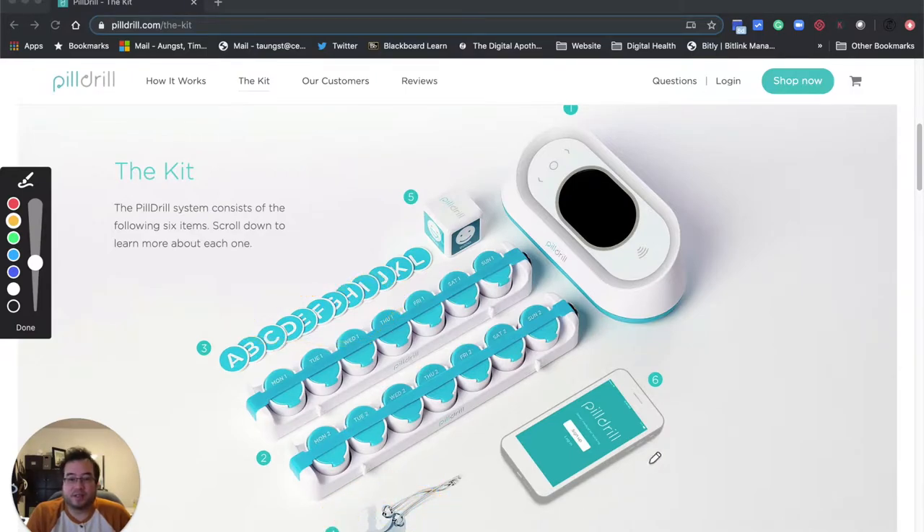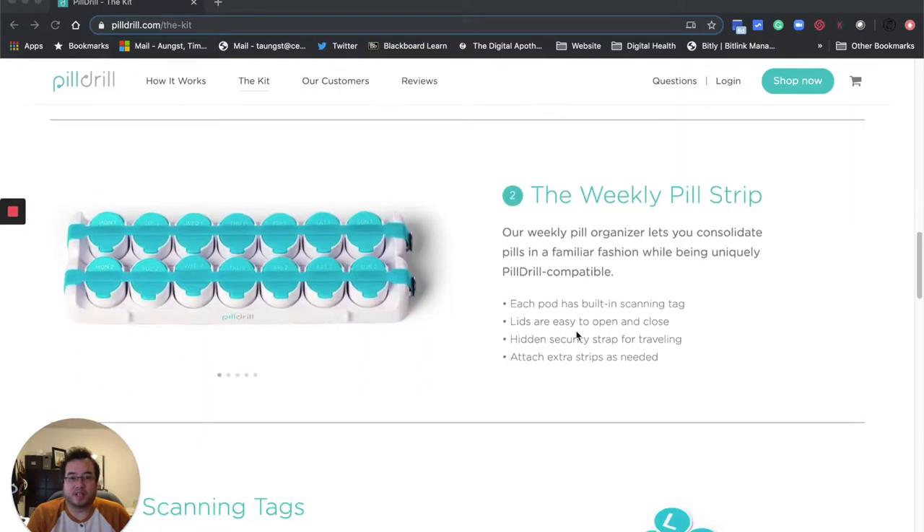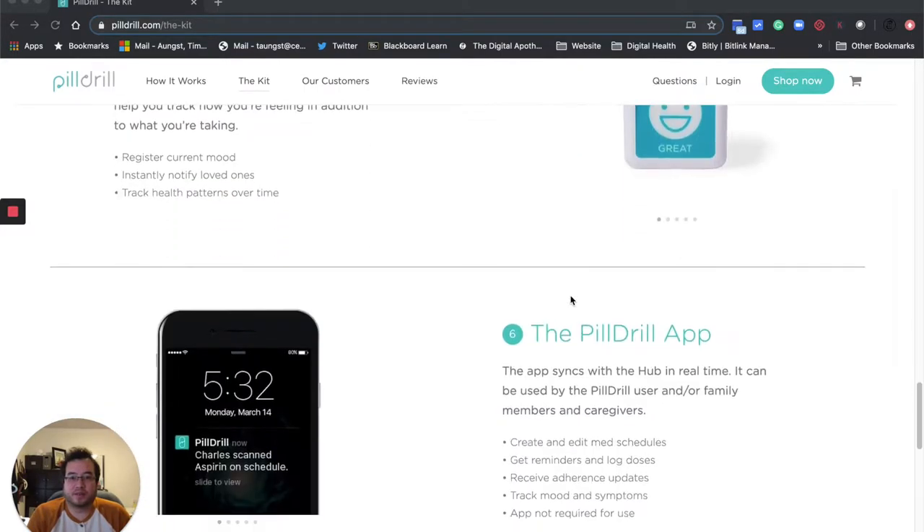There are charms that you can put on like an inhaler, and it connects through an app. One thing I really like that I haven't seen in many other products is this little cube here. It's a little cube, and what you do is you can scan that next to the hub. From that, you can actually denote what your mood is — you can say you're good, you're bad, and other things. I think that's pretty cool. The hub has the time and will light up and tell you when to take your medications. The kit includes a pill strip, scanning tags, tag holders, and a mood cube.